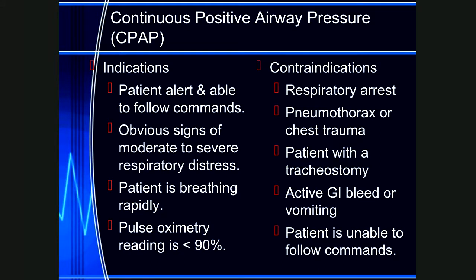If the patient shows any signs of deterioration while using the CPAP, remove the CPAP and begin positive pressure ventilations using a bag valve mask.